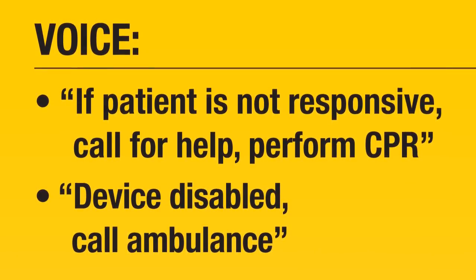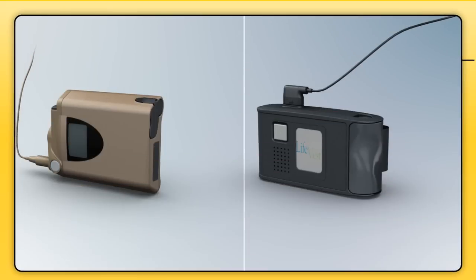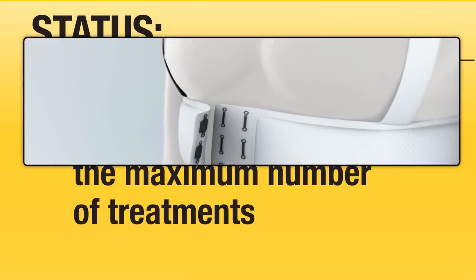These prompts mean that the LifeVest may be detecting an untreatable rhythm, such as asystole, is unable to detect an ECG signal, or may have delivered the maximum number of treatment shocks in a treatment sequence. In these situations, proceed with your standard evaluation and treatment measures. You may decide to disable and remove the LifeVest and use your own monitoring and defibrillation equipment. Again, to disable the LifeVest, simply pull out the battery, then unclasp the hooks at the front of the garment and remove the device.